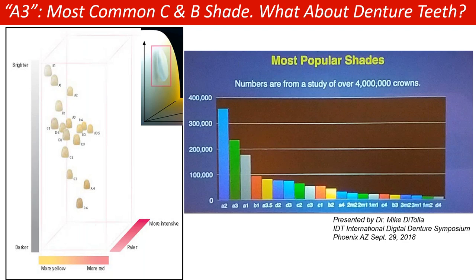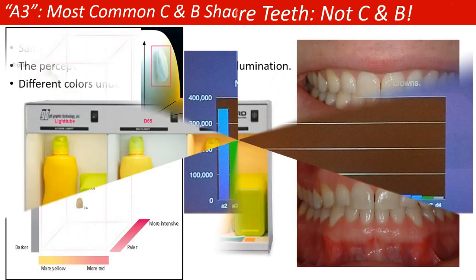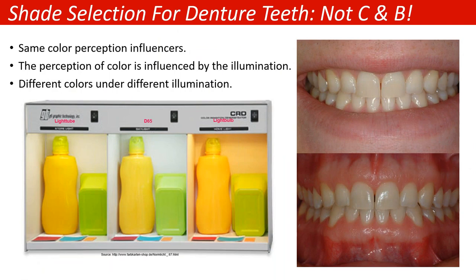Mike Dottola, at one of the denture symposiums a couple of years back from Glidewell's, looked at the total number of prescriptions they received, and the majority of them were all A2. A2, A2, A2. Well, again, you want to look at denture teeth, the shades of denture teeth.